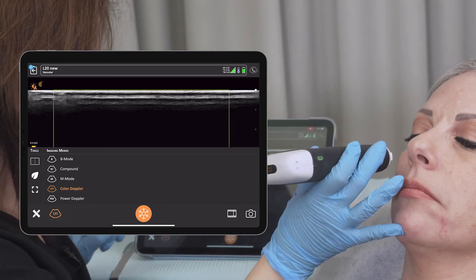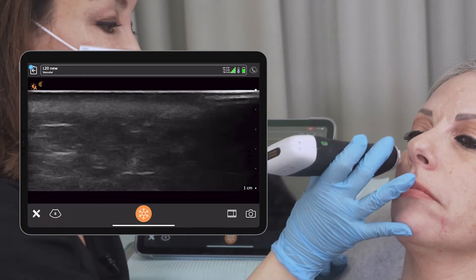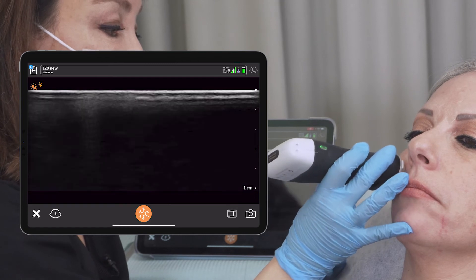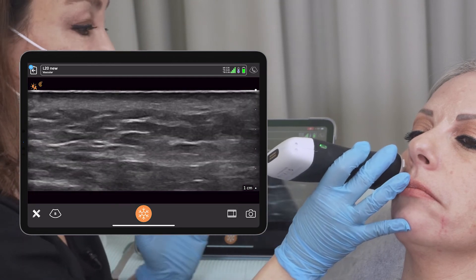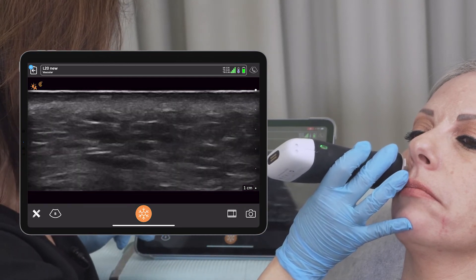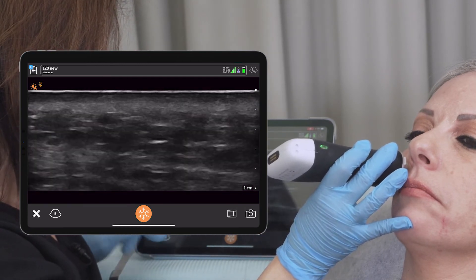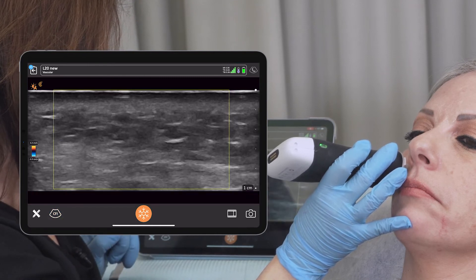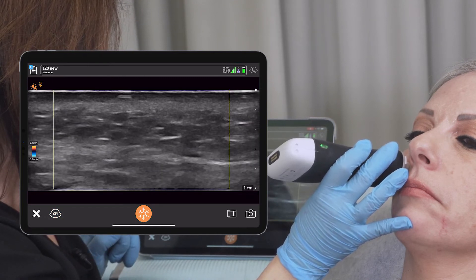So here we can actually check for the vessel. I'm performing the color Doppler now.